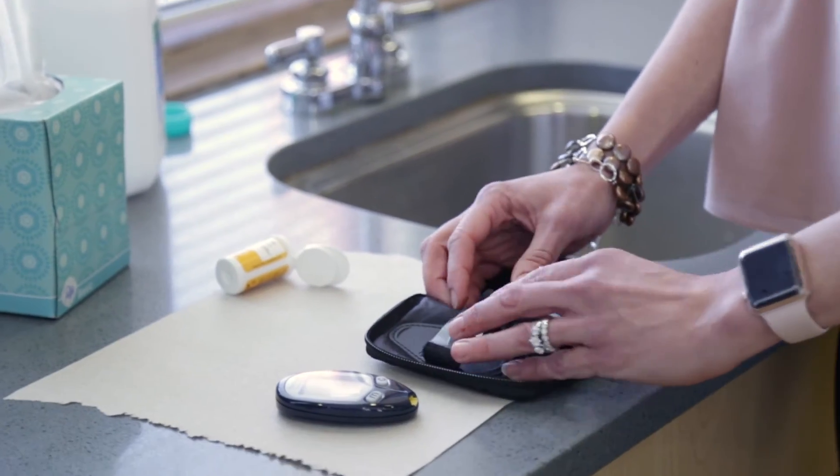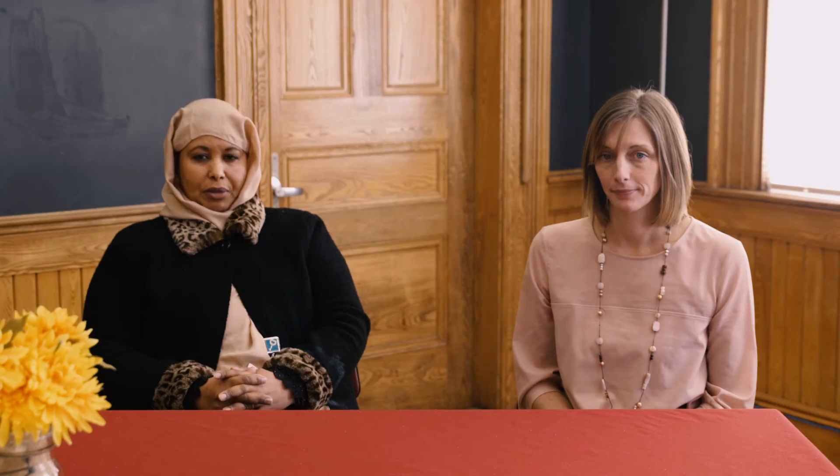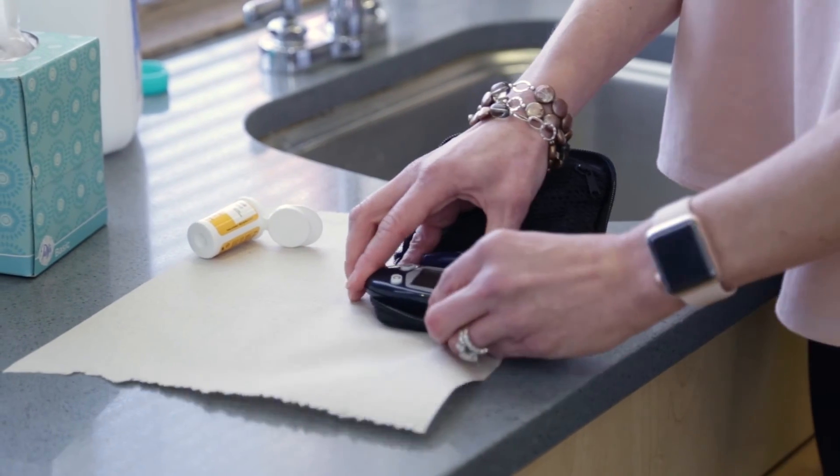Replace supplies into the blood sugar meter case until next time. Bring your meter with you to any appointments with your care team.